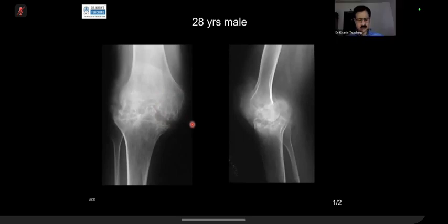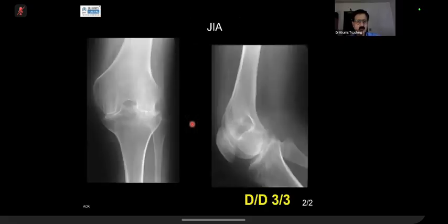Why is it broad? Because of the bleeding tendency and secondary hyperemias. So what happens in secondary hyperemia? Because of increased blood supply, the bone tends to overgrow a bit, so it tends to appear a bit larger. Well done, well done. Let me take over.